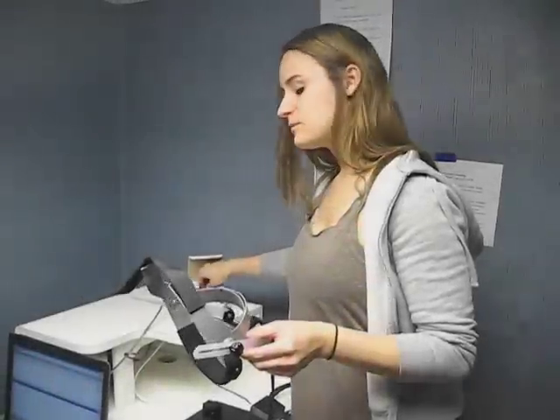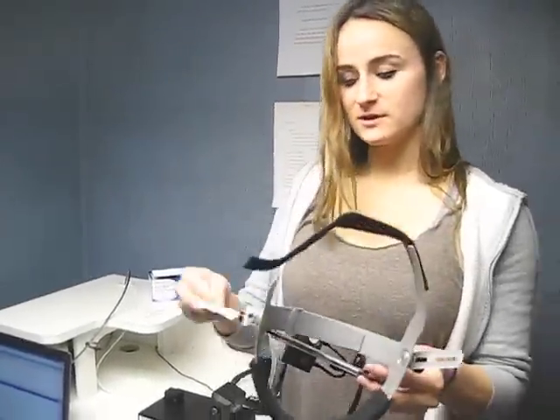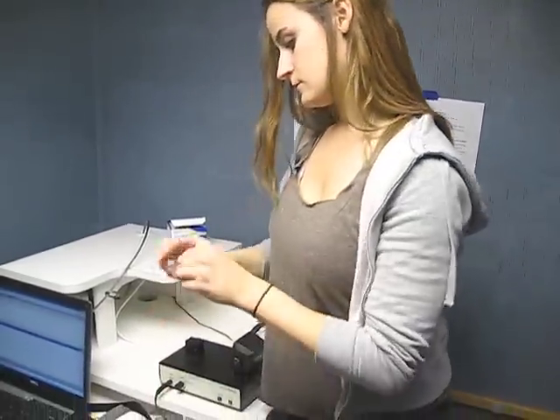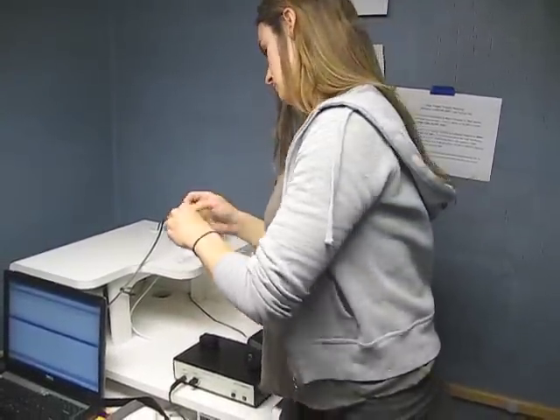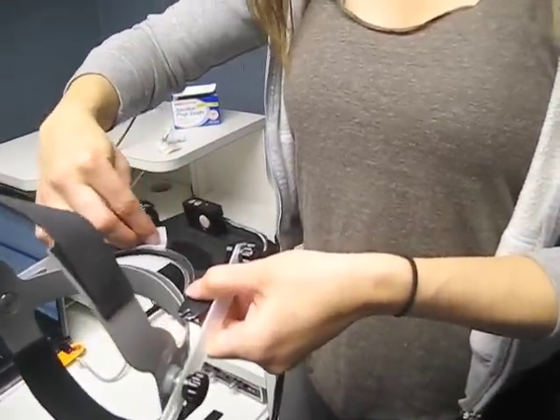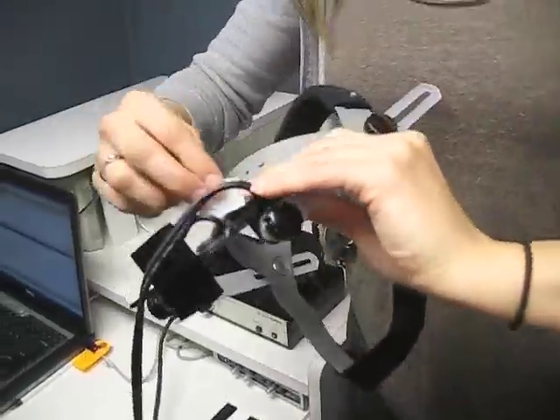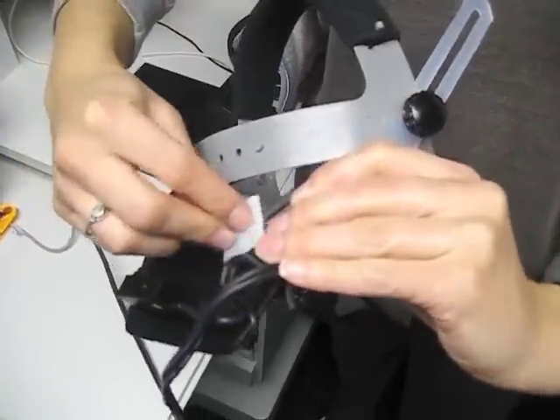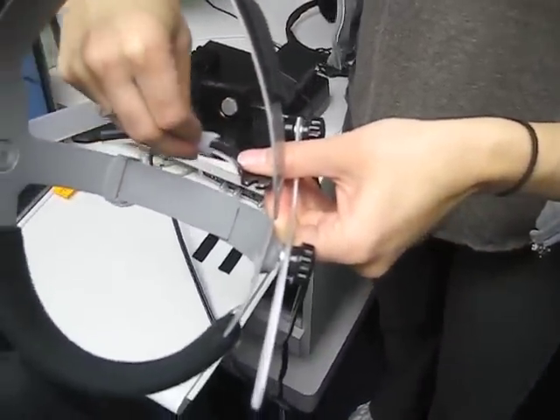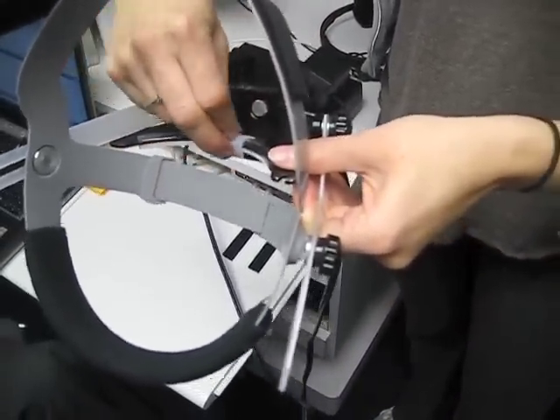A value of 0.98 — anything between 0.9 and 1 is acceptable for calibration. Before you place the nasometer headset on the patient, always make sure you wipe it off with an alcohol wipe. Wipe off the top part where the nose touches and the bottom part where the lips touch.